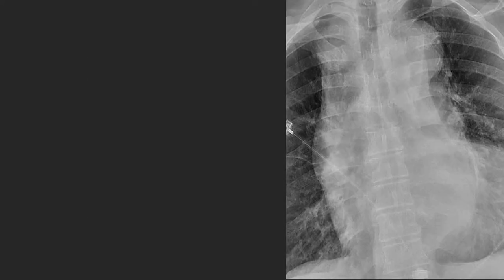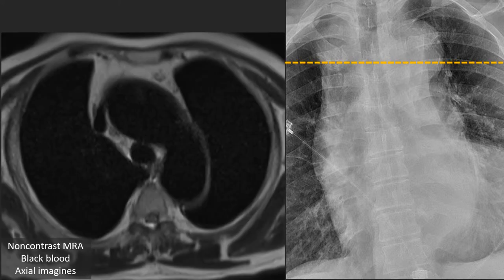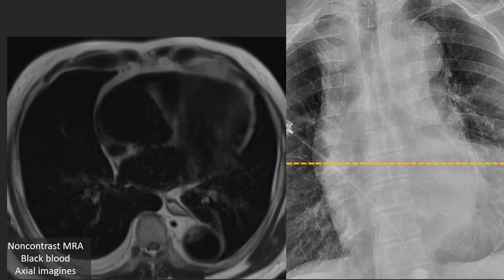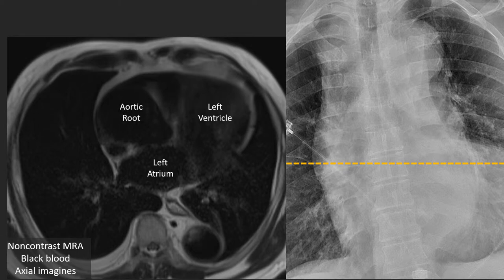This patient has a known aortic aneurysm and has been undergoing annual surveillance imaging with MRI. Aneurysms can be surveilled with CT or MRI, and this patient was being followed with the latter. This is an axial non-contrast MRA black blood image of the aorta at the level of the aortic arch. As we move more inferiorly, we can see the ascending as well as the descending thoracic aortas. The ascending aorta is aneurysmal, measuring 5.7 cm, and has been slowly enlarging over the last few years. A more caudal image demonstrates the aortic root, the descending thoracic aorta, as well as some of the cardiac chambers. We also note that the aortic root — just beyond the aortic valve and proximal to the sinotubular junction — is also aneurysmal. Given gradual growth, this patient was electively repaired.